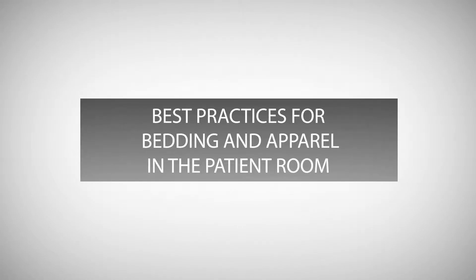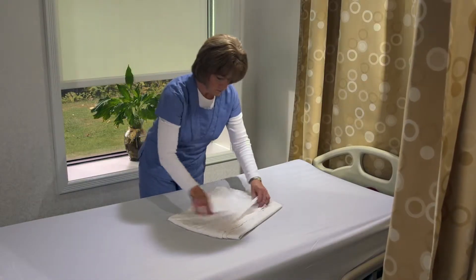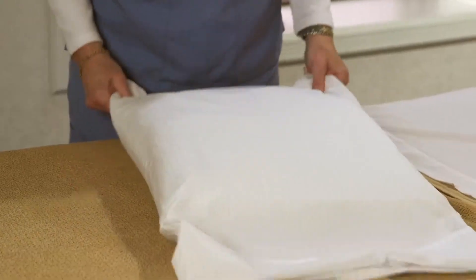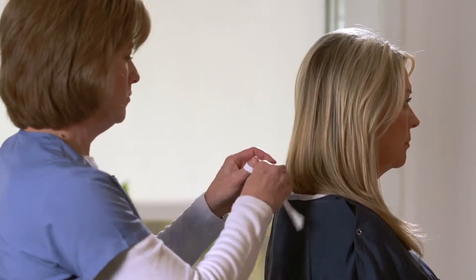Best practices for use of Dermatherapy bedding and apparel in the patient room. The Dermatherapy system consists of the fitted sheet, flat sheet, pillowcase, underpad, and patient gowns.